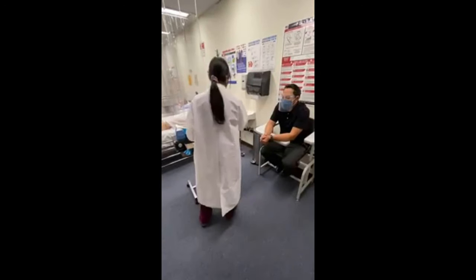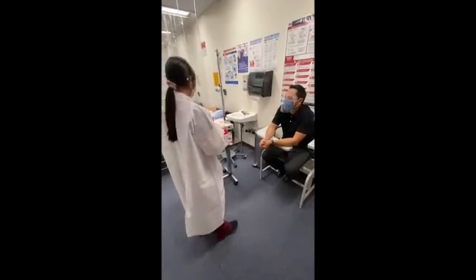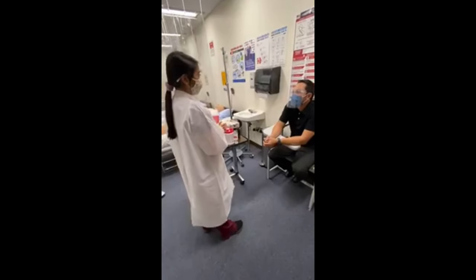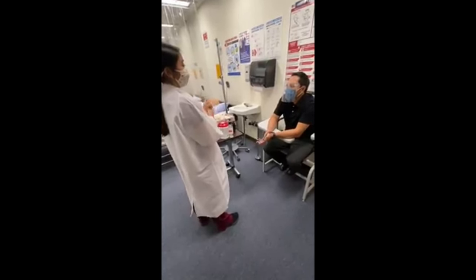10-6-98. Yes. Okay. Do you have any allergies? Allergies? No, nothing. Did you have anything within the last 10 to 12 hours? No, I didn't have anything.